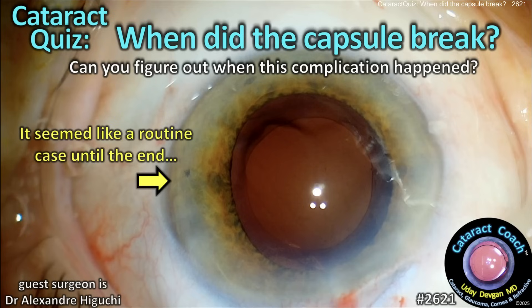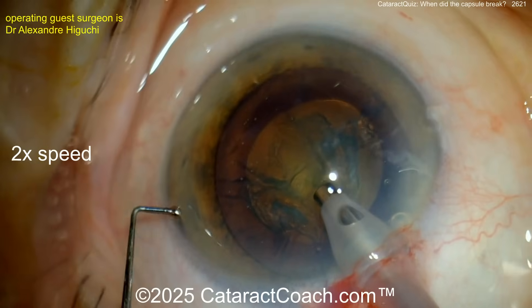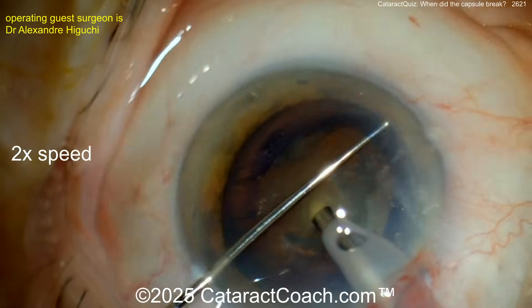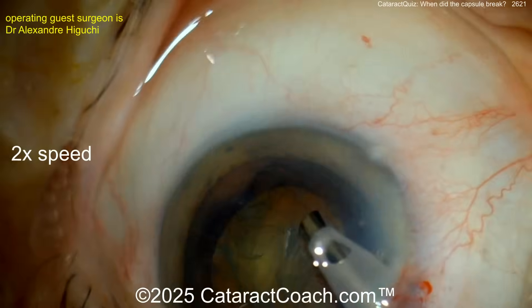CataractCoach.com cataract quiz: when did the capsule break? Can you figure out when this complication happened? Watch carefully. This looks like a totally routine cataract case. Trypan blue dye was used, and we have a beautiful capsulorrhexis going in here.